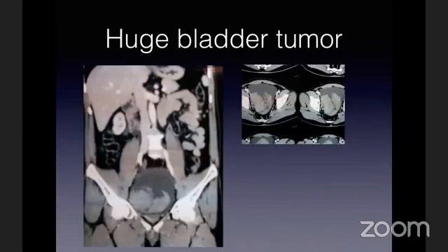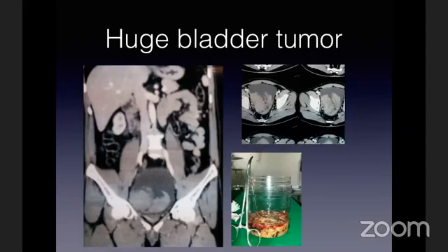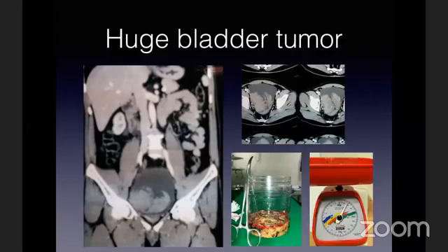This is one of the largest tumors we removed — half of the bladder was filled with tumor. On coronal CT scan images, urine was seen between the tumor and the bladder wall, suggesting it would be possible to get under the tumor. Interestingly, we could remove the tumor well. I had to use morcellation to extract it. The resected weight was nearly 170 grams.